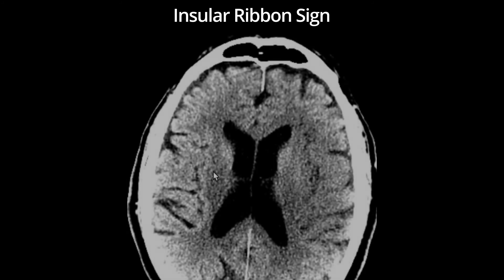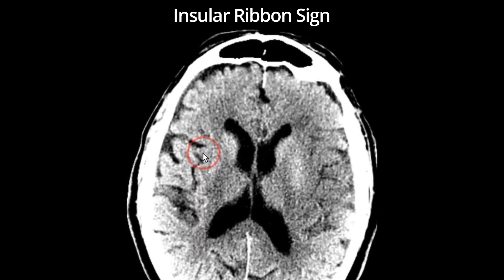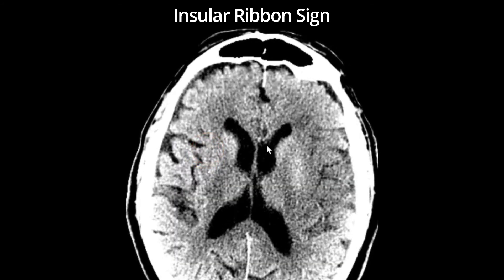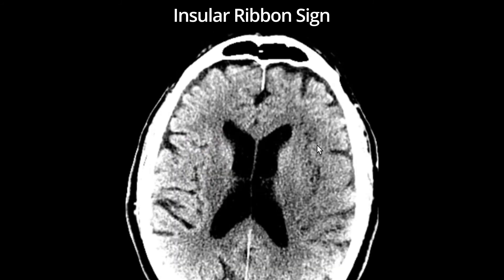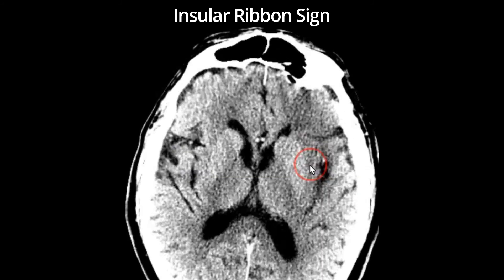Here is an example of the insular ribbon sign. Notice on the right that the gray matter of the insula is maintained. However, on the left, the insula is not well-seen and is hypoattenuating. This case is shown on stroke windows, which makes the finding more obvious.